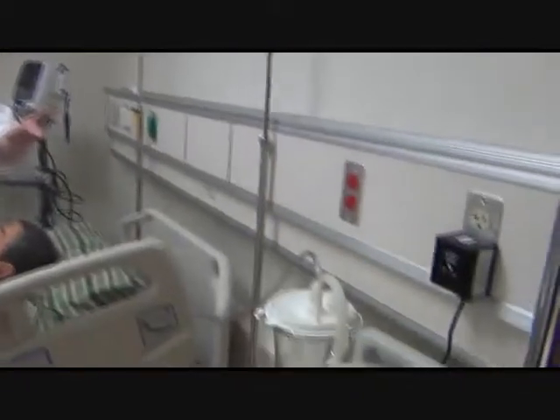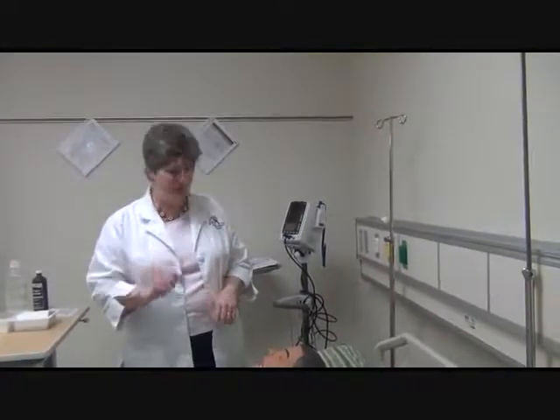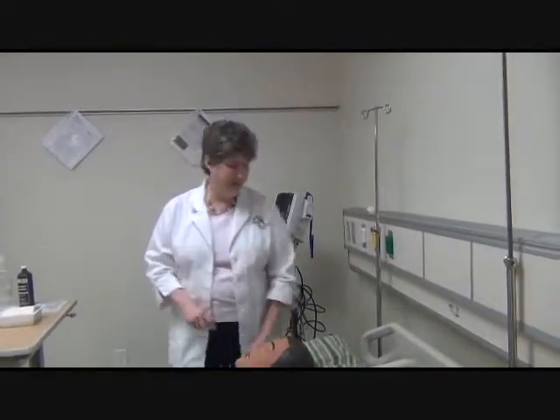You also need to have working suction, and that can be a head wall unit, or like in our example, we have the bedside table. So you want to make sure that that is working, and I'm going to ask one of the students to turn that on so that we know that it is. So you want to test that equipment.